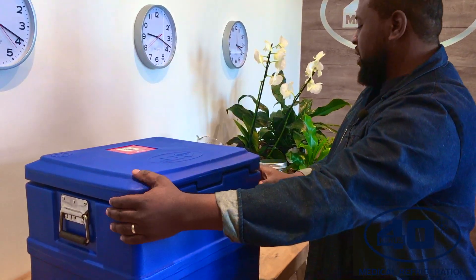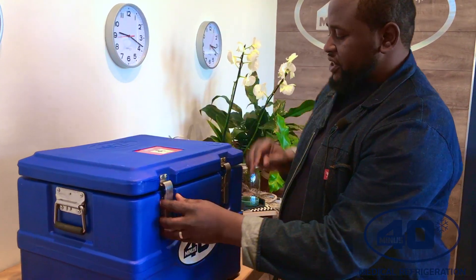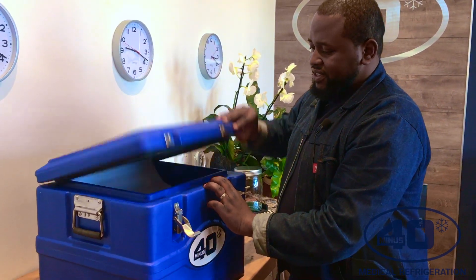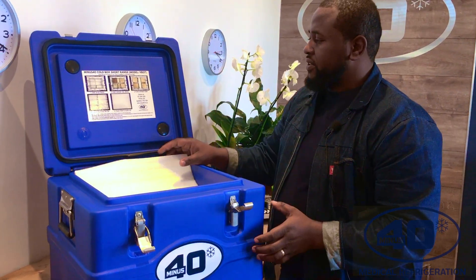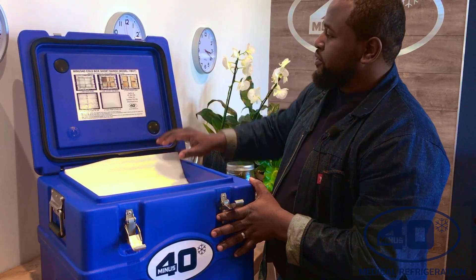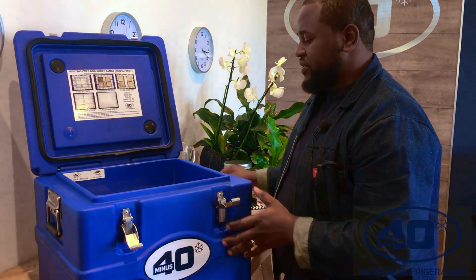We can open the lid at 90 degrees for easy loading of vaccines. I will open the vaccine cold box. You'll see it's open and at a slightly higher angle than 90 degrees. And then what you'll see is the information on how to load your vaccine.